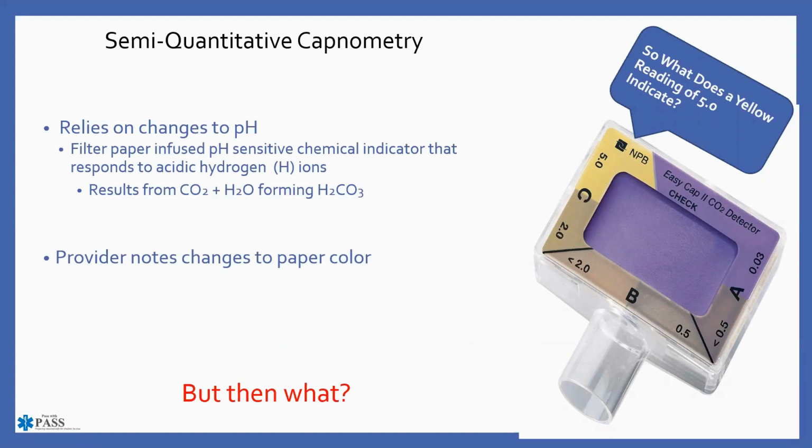And just to cut to the chase, if you have a tube through the glottis in an apneic patient, you put waveform capnography on it, and there's any variation of a square waveform, then your tube is through the glottic opening, because we know that an esophageal intubation is not going to produce end-tidal waveform capnography. So if you do have a waveform, then we know that our endotracheal tube is through the glottis.